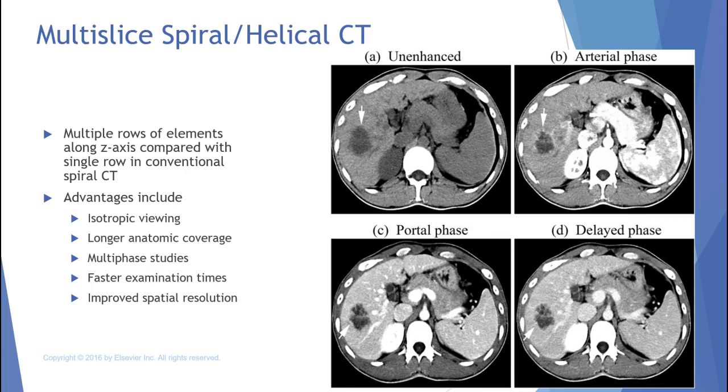And this is just some more images of what we take pictures of, and as you can see, there's a pretty big lesion in the liver, okay? And the fact that it's not filling in that delayed phase, we would do another 10-minute delay. We just leave the patient on the table to make sure that doesn't fill. If it does fill, it would be a hemangioma, which is benign, no worries. If it doesn't fill, we got a problem.